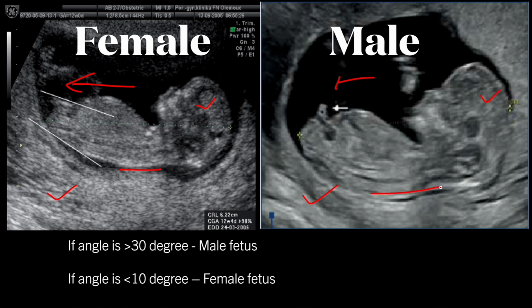Once you identify the fetal spine, you should follow the spine caudally. On the caudal part of the fetus, where the spine ends, you can see a small protrusion. This protrusion is located in the region from where the fetal legs should normally arise. In ultrasound, genital tubercle appears white in color. It means genital tubercle is an echogenic structure at the caudalmost part of the fetus.